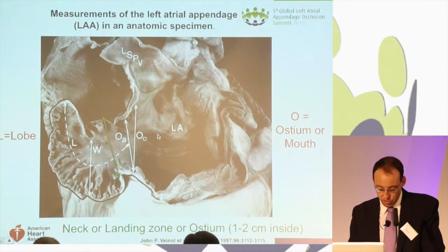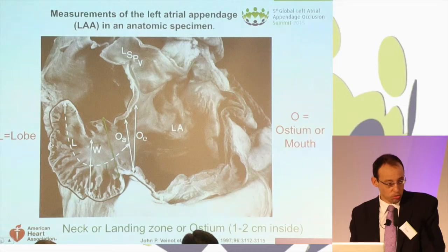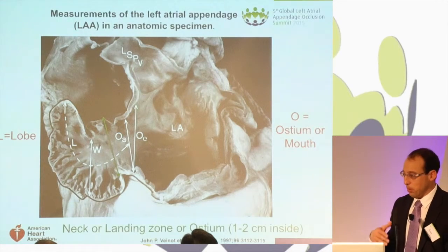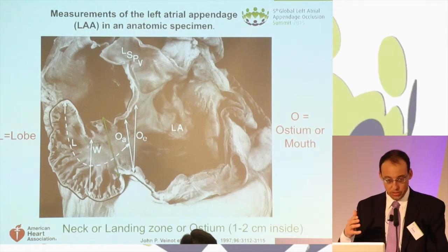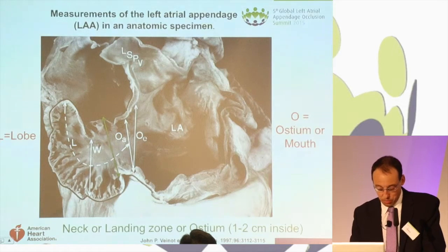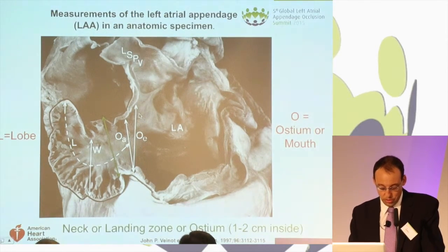He mentioned the ostium here. He mentioned the neck. He mentioned the lobar region behind, so the most variable part of the appendage. But we should probably translate that also in the lab when we talk to each other with the echographer, with your partners. And we can potentially find other terms for what Andrew mentioned.